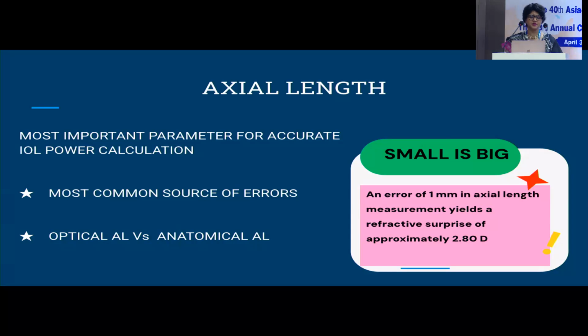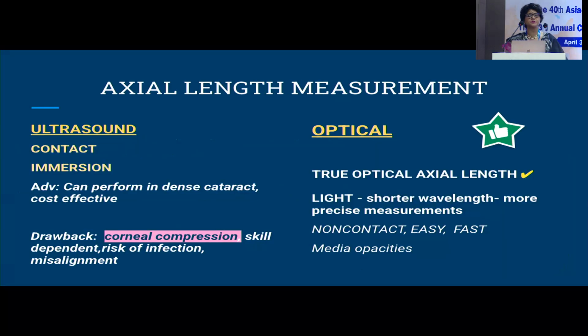This is the reason that nowadays we are going more for the optical equipment like the IOL Master, because it's going to measure the true optical axis.